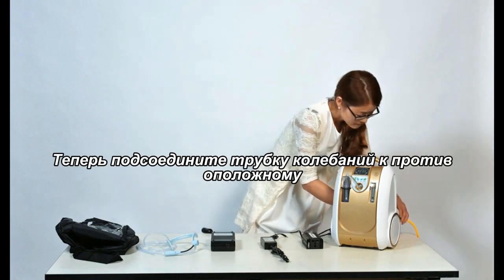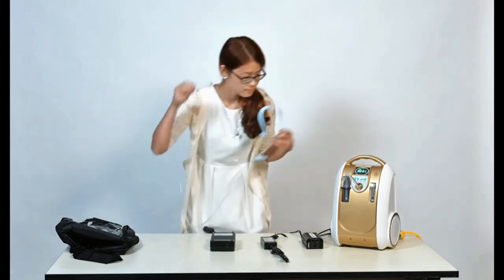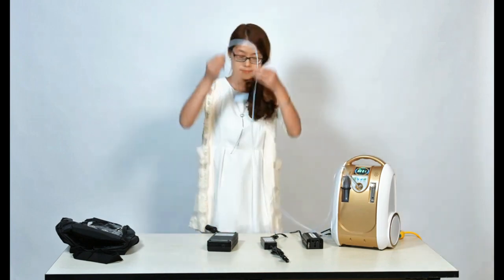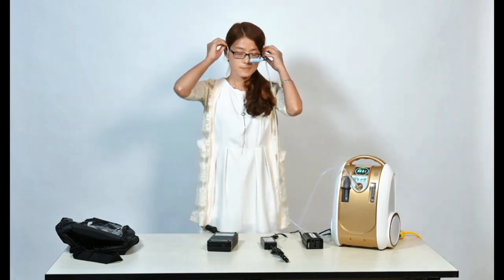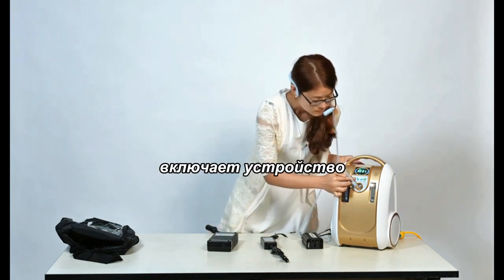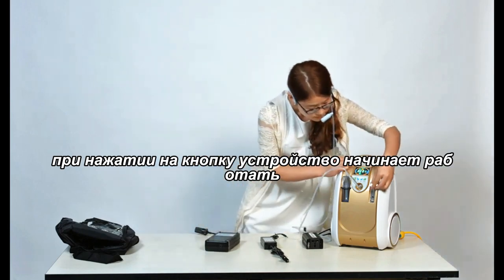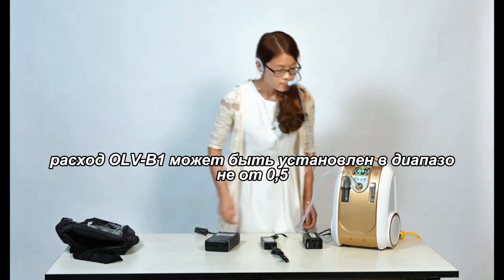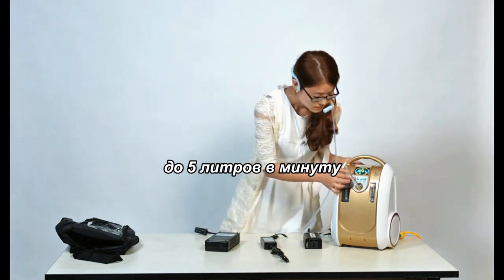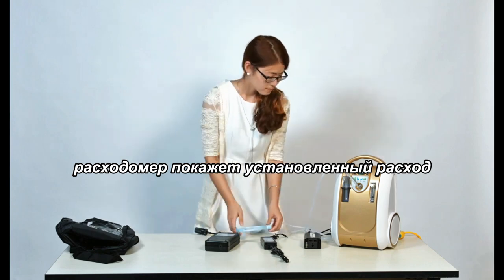Now connect the headset tube to the oxygen outlet port. Turn the unit on by pressing the ON-OFF button. The unit begins to work. The Olive O-AirVB1 flow rate can be set from 0.5 to 5 liters per minute. The ball inside the flow meter will indicate the flow rate setting.